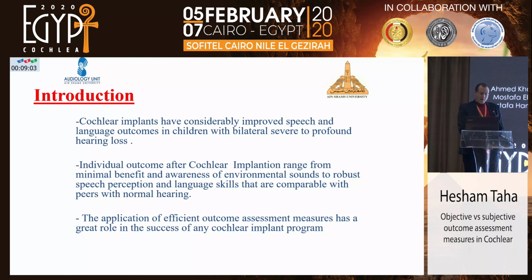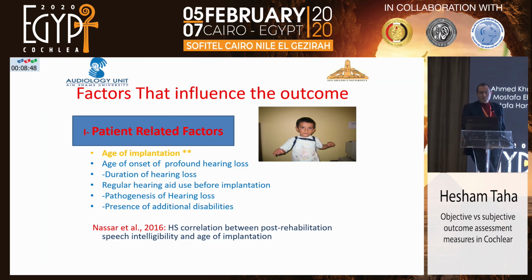So we have to apply efficient outcome assessment measures to evaluate the outcome and to be a cornerstone in the success of cochlear implantation programs. There are many factors that may influence the outcome.